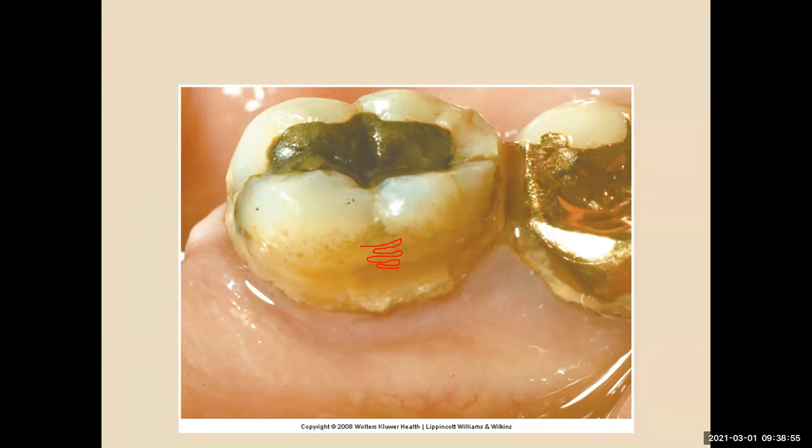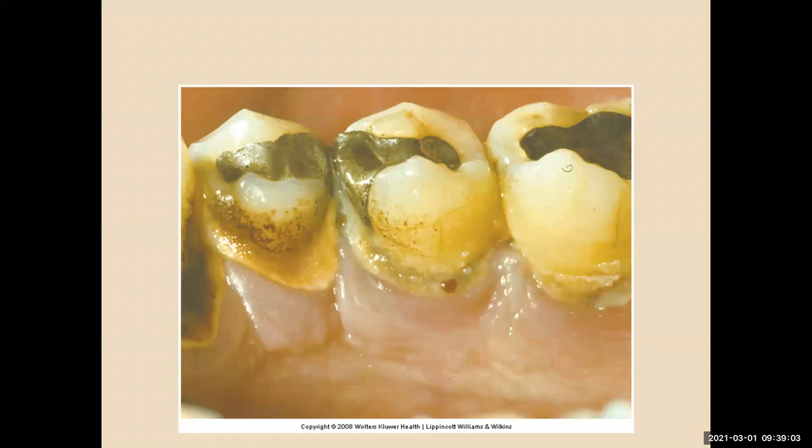You could use your triple bend here, and then switch to a slim line. Can you just imagine? This is so much fun to get your hands on.